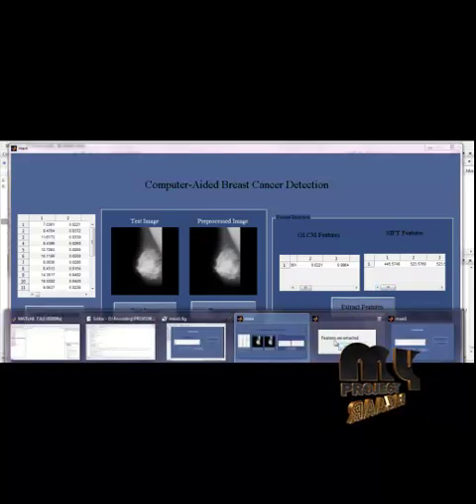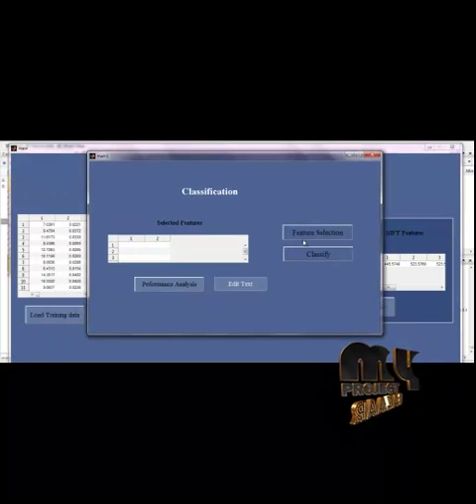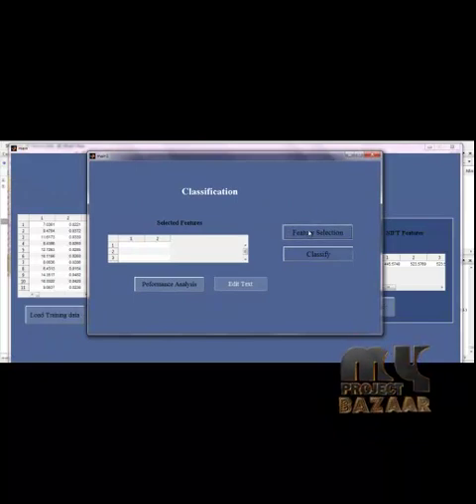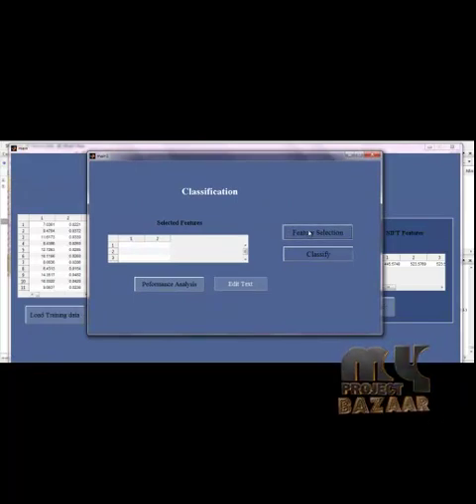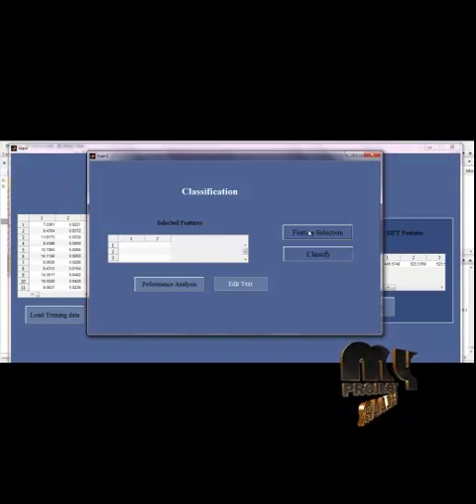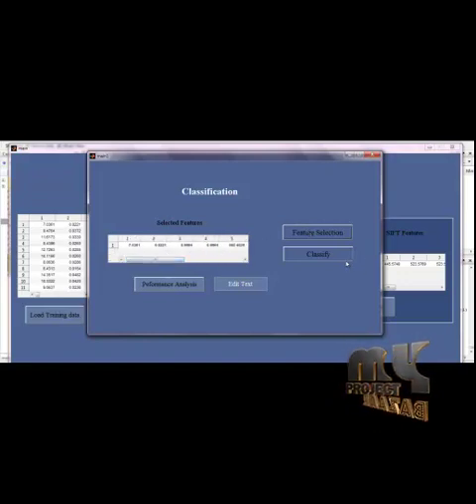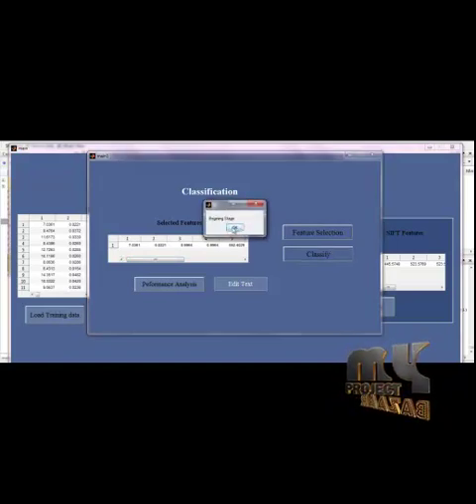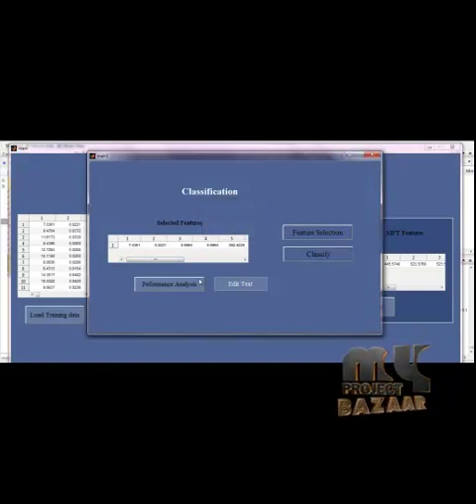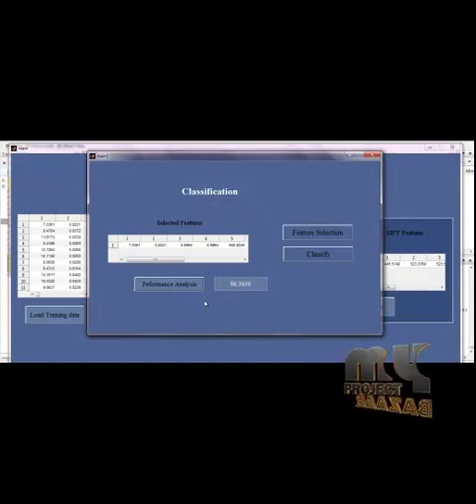The second window will be opened. When you click on the Feature Selection button, the extracted features are selected and the values are displayed. Finally, we classify the image. The result shows a benign stage, and we measure the performance of the classifier. Thank you.